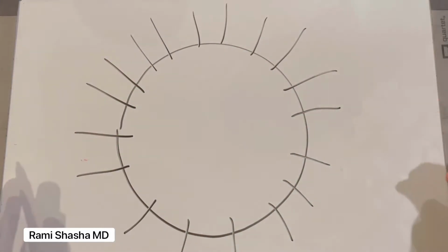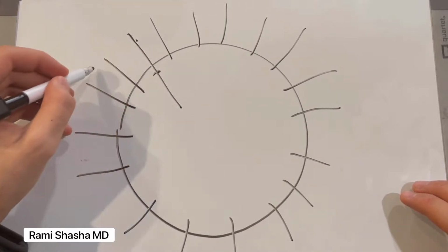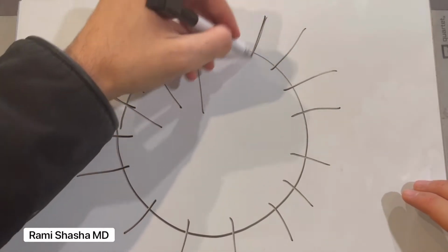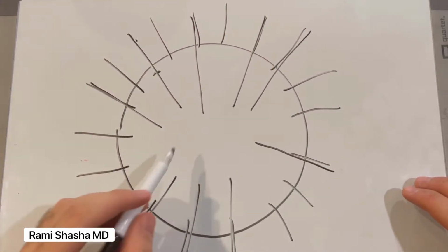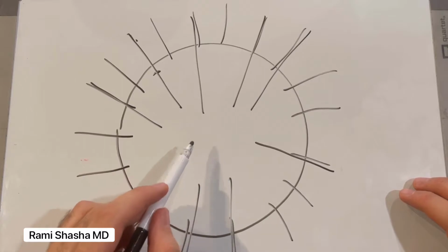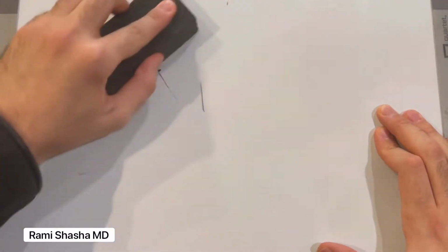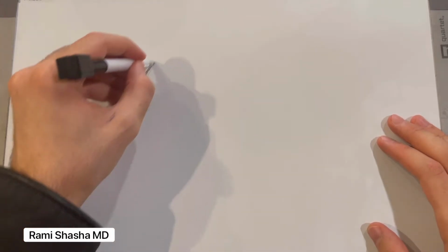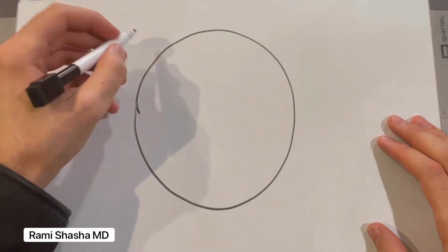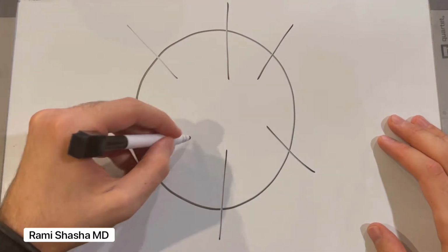Well, long anterior zonules is a specific entity where the zonules don't stop here. They actually insert more anterior, and it can be a very subtle sign that you may not recognize at the beginning of surgery. If you don't recognize this condition, it can lead to a lot of complications. So what do I mean by that? Well, let's assume you start the case. So here's our well-dilated pupil, and the surgeon doesn't recognize LAZ, okay?